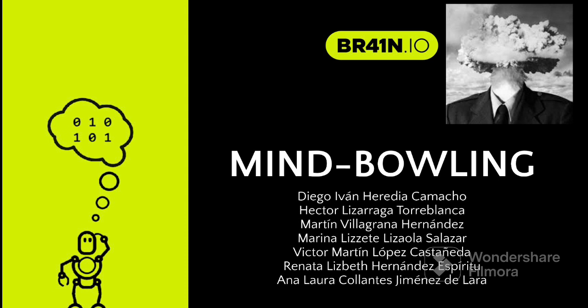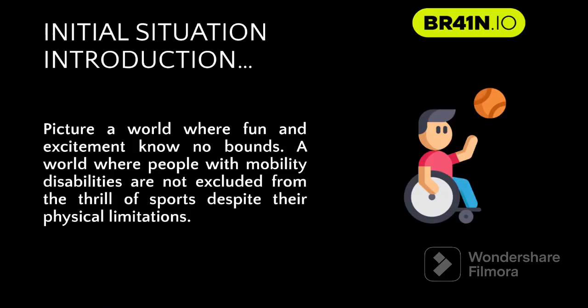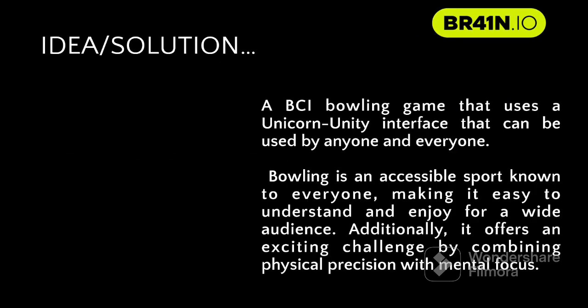And today, we're bringing to you Mind Bowling. Picture a world where fun and excitement know no bounds. A world where people with mobility disabilities are not excluded from the thrill of sports despite their physical limitations. Picture a BCI bowling game that uses a Unicorn Unity interface that can be used by anyone and everyone.